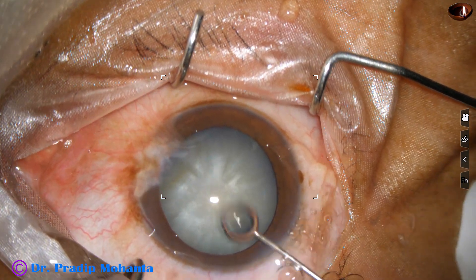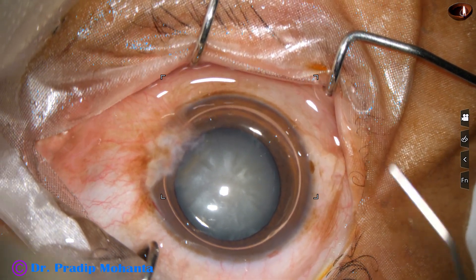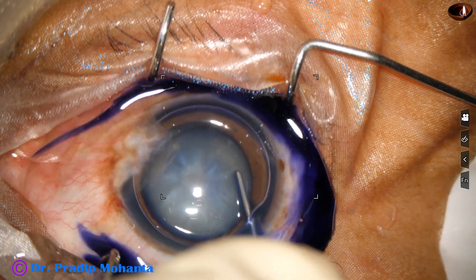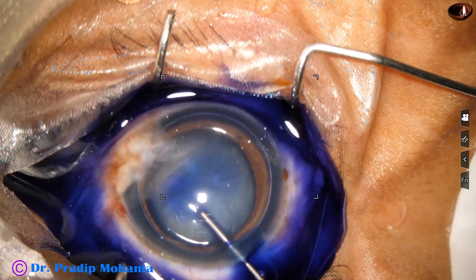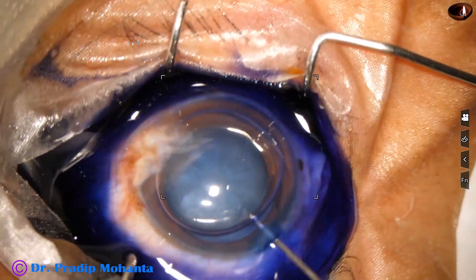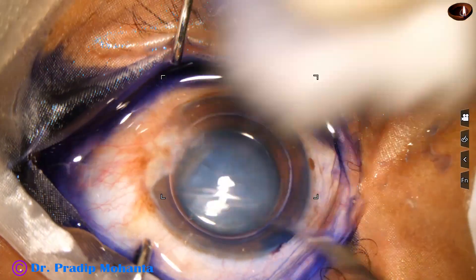Now an air bubble is injected to fill the anterior chamber. Beneath this air bubble, trypan blue dye is applied over the anterior capsule. The dye should touch all parts of the anterior capsule. Now this is a bit of adrenaline. Then the dye is washed out with BSS or Ringer's lactate.